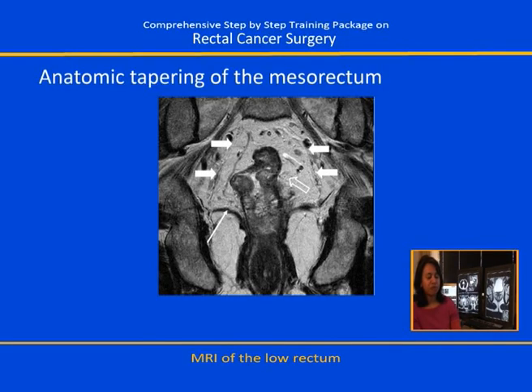And here, just above the puborectalis sling, as you remember, the danger point is exactly where we would expect to see those perforations that we tend to see with the abdominoperineal excisions performed in conjunction with the TME. So this is something that if we can image beforehand, the surgeon can be warned about, and perhaps they wouldn't then do the TME operation all the way along the surface of the levator.